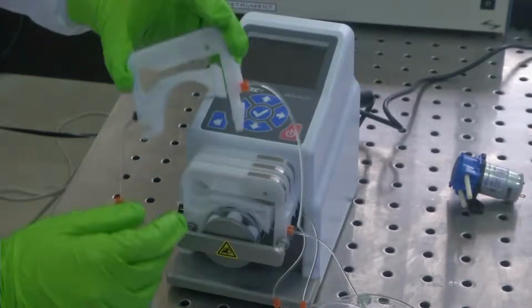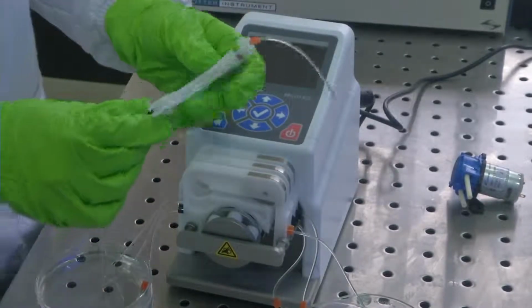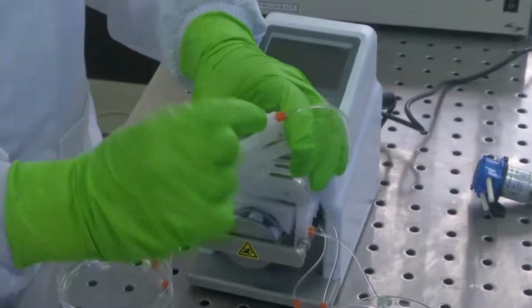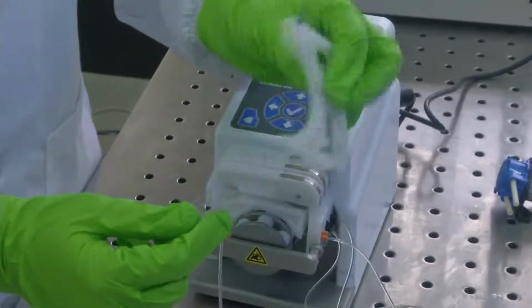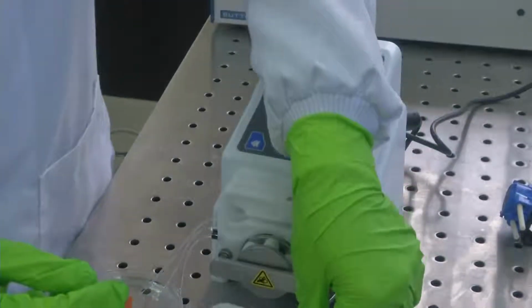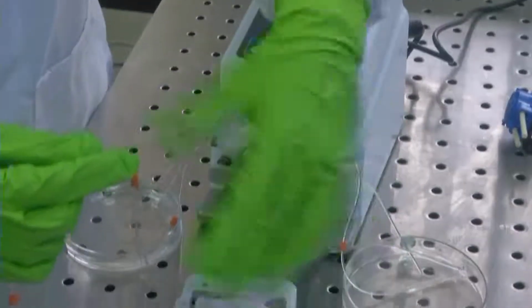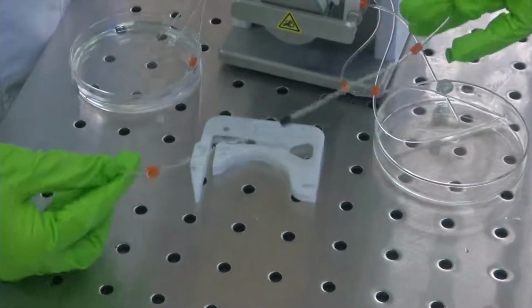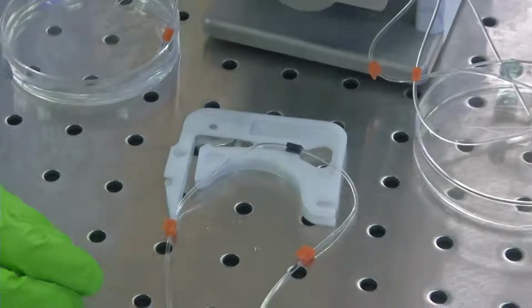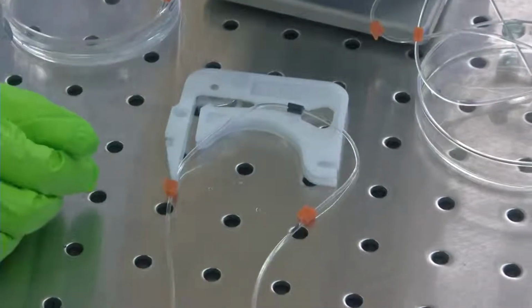So this is one cassette in his hand. You could see the tubing. These are the silicon tubings. Each of these cassettes will have the tubing which would be fitted into the channels. The one in his hand is the channel through which the fluid flows.